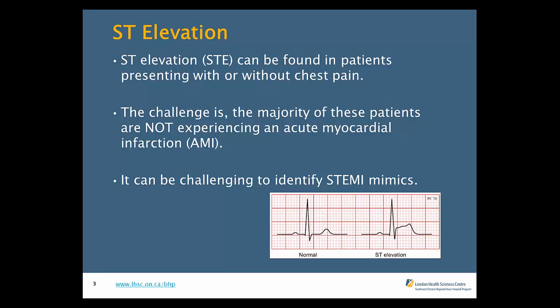And like Mike says, there are a lot of causes of ST elevation out there. Working with residents at an academic center, one of the questions I often get is, name me 15 causes of ST elevation. As each year they progress through residency, that number creeps up: it starts off at name me 10, name me 12, name me 15, name me 18 causes of ST elevation on the ECG. So there are many causes out there. A lot of them you may never see in the pre-hospital setting. But we'll go through some of the more common STEMI mimics here today. The good thing being we're only going to talk about 3 or 4, not 15. Those are the most common causes that we will go over today.